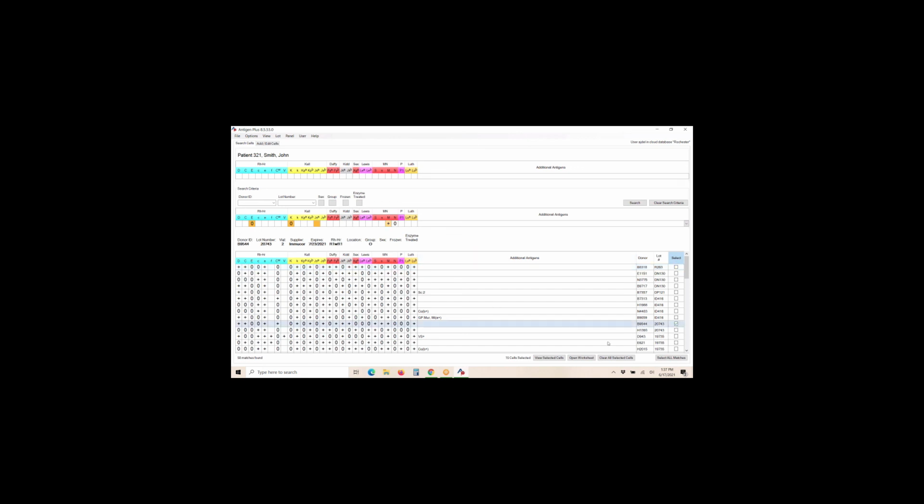That's a manual cell. And if you've already had a cell picked, it would show up down here. I don't know if there's any that's going to show up for this particular search. No, it doesn't look like it. But if you'd already have a cell selected, it would already be check marked. So you're not going to be in danger of check marking it again.